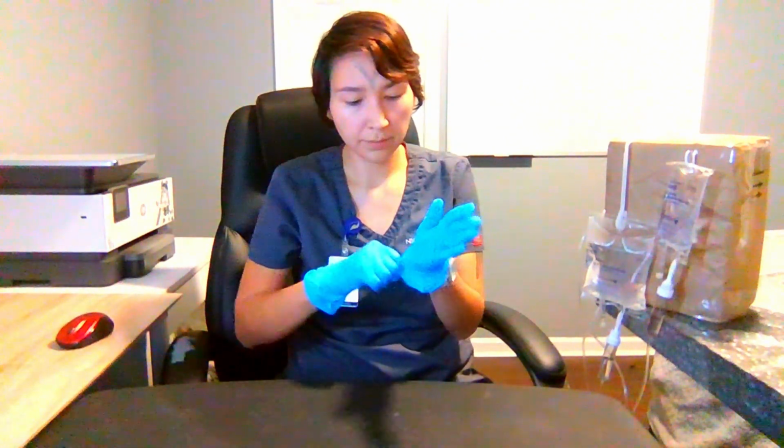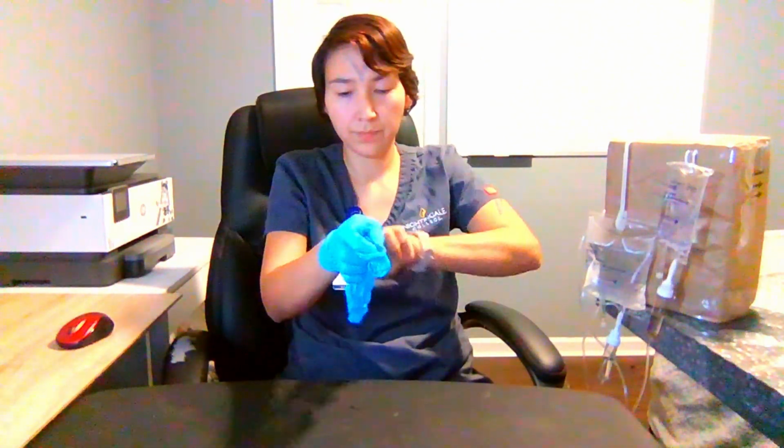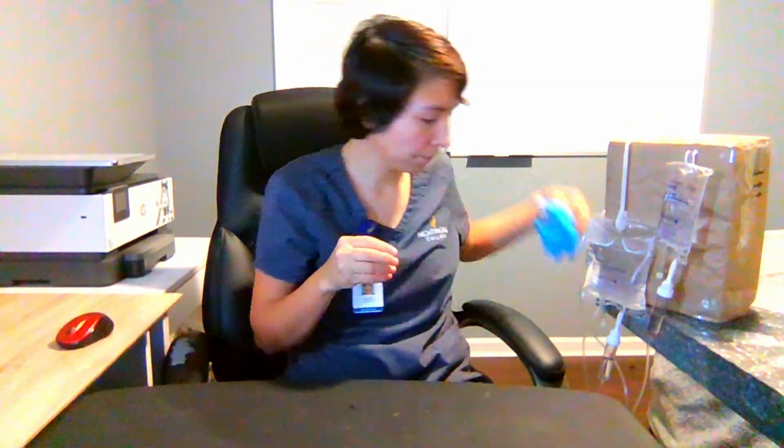Remove my gloves. Dispose of these appropriately. Perform hand hygiene. Assess the IV after it's been completed, and document the procedure.